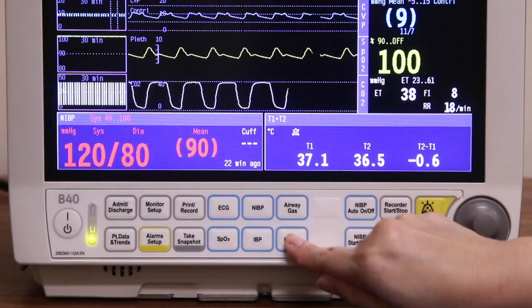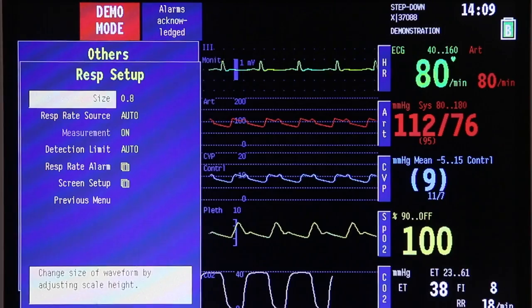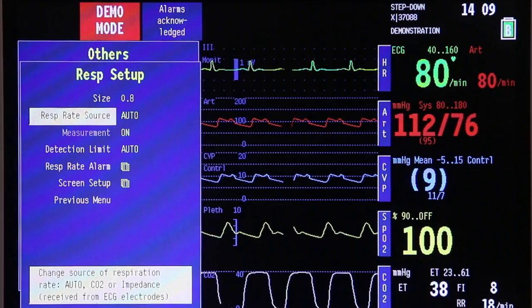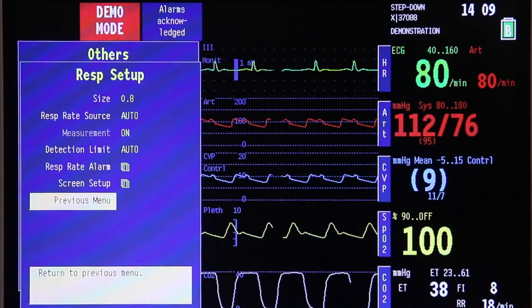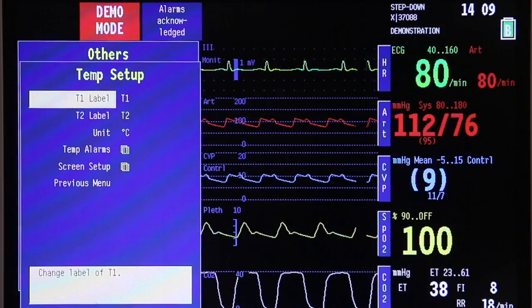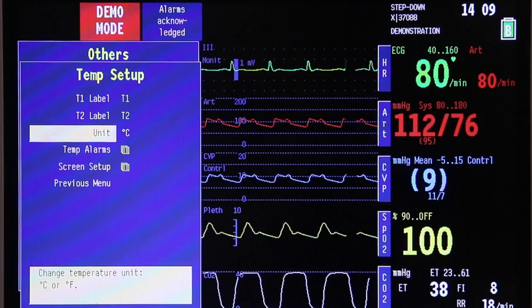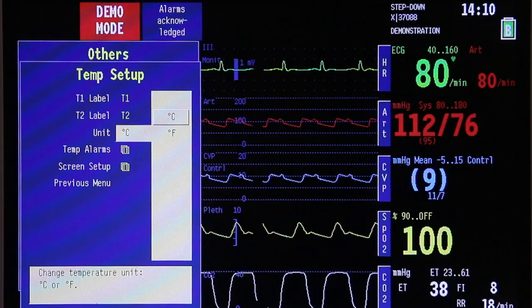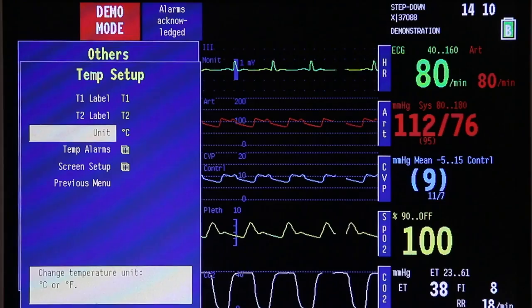Next up on the command key panel is others. Once you open it, you will see other parameters that can be adjusted, such as respiratory setup — wherein you can adjust the size, respiratory rate source, detection limit, and respiratory rate alarm. Once done, go back to the previous menu, where you can adjust the temperature setup next. Under temperature setup, it will ask you to label the two temperatures being monitored, the unit of measurement — whether centigrade or Fahrenheit — and temperature alarms, which can also be adjusted on the alarm setup page. Once done, go back to previous menu.